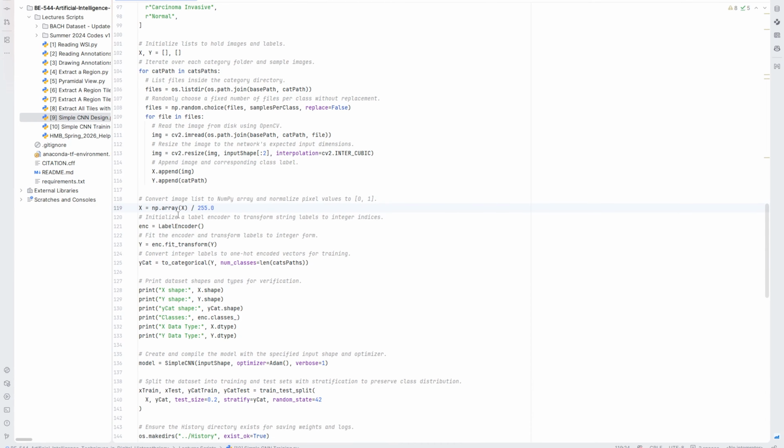Next, we are applying what is called normalization. And the normalization here helps to avoid an issue called overfitting and helps the model to converge to the best loss function easily. So instead of teaching the model on the actual values, which range from 0 to 255 because we are dealing with images, whether gray or colored, we decrease that range or domain to be between 0 and 1. So any mathematical operations or convolutions that we apply on the images will be applied on the small range rather than the wide range.